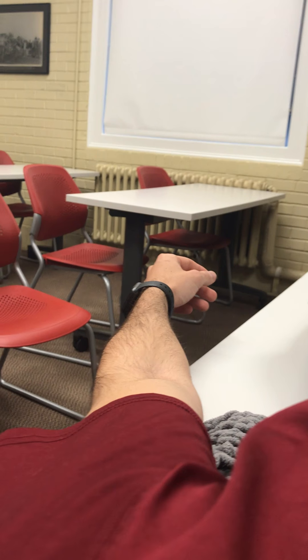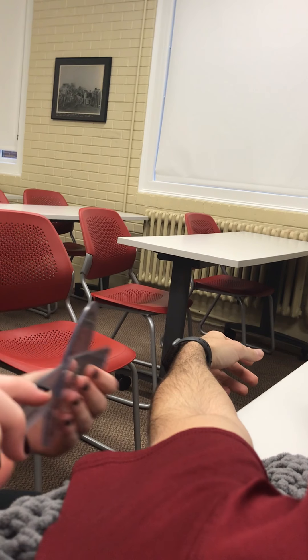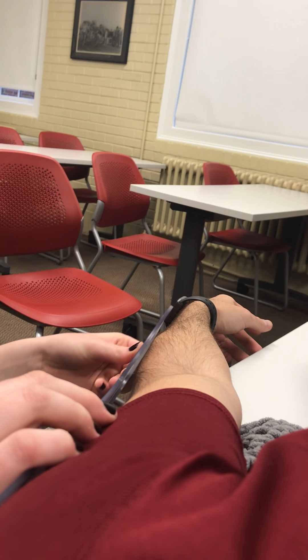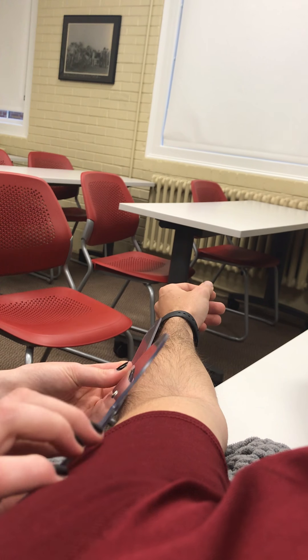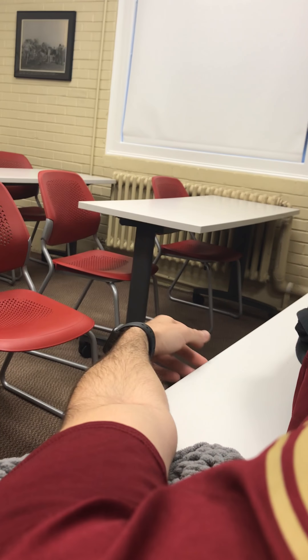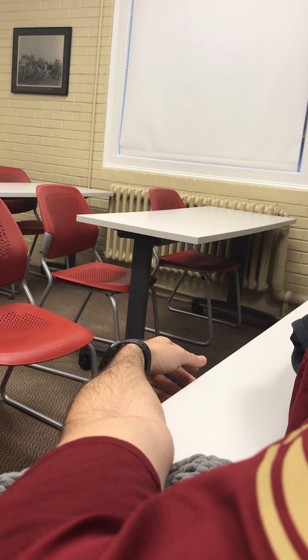I am part A, and we're going to start out with active range of motion for flexion, so if you can bring your hand to your shoulder. So now I'm going to line up the fulcrum on the lateral epicondyle. The stationary arm is going to be in line with the acromion process, and the movement arm is going to be lined up with the radial styloid. So go ahead and flex. You're supposed to have 145 to 155, and he has 146, so he's in a good range.